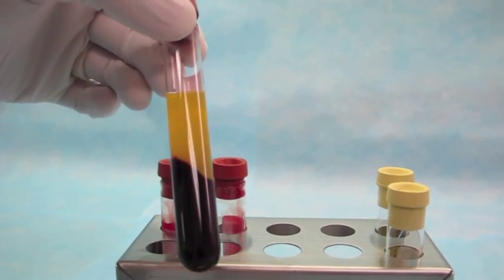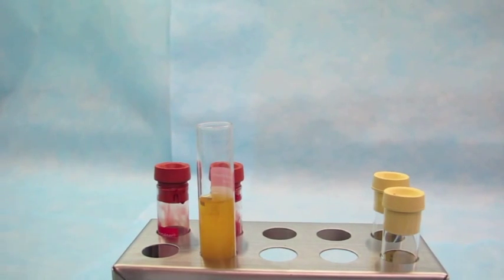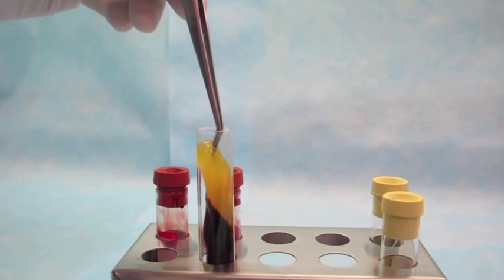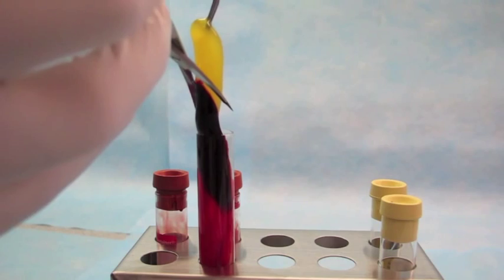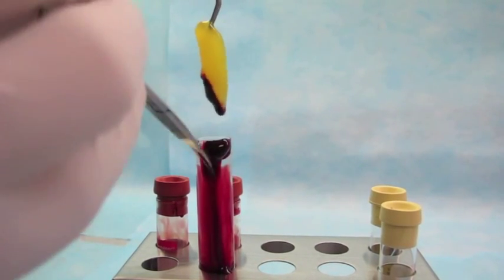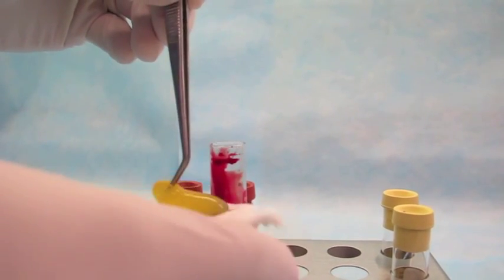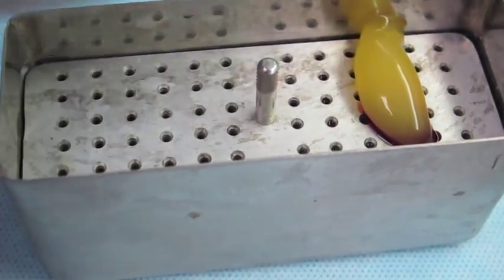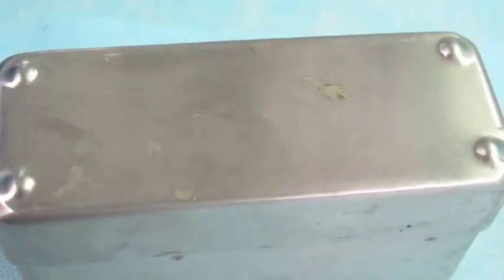After the spin, pull the tubes out. You can see the red blood cells have been spun down to the bottom as they're heavier, and there is a fibrin clot in the middle and a supernatant — the platelet-poor plasma — on top. Release the top, place your cotton pliers in, and pull the clot up out of the tube. The red blood cells will very often come with the clot, and you'll want to trim those off. Don't trim them all completely off, though, because much of the buffy coat layer and the growth factors are contained within a little bit of the red blood cells. Cut those off, blot away some of the red blood cells keeping the buffy coat layer, and place that clot into your holder, then place the weighted squisher on top of it and close it to keep it moist.